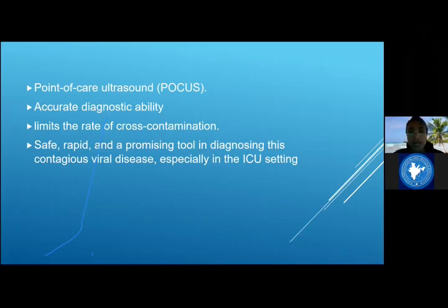So I'll be dealing with it not in great detail, but in short. Now, lung ultrasound is actually the imaging modality that we use in diagnosing as well as following up a patient with COVID-19 pneumonia. It has accurate diagnostic ability. The main advantage is that it limits the rate of cross contamination.